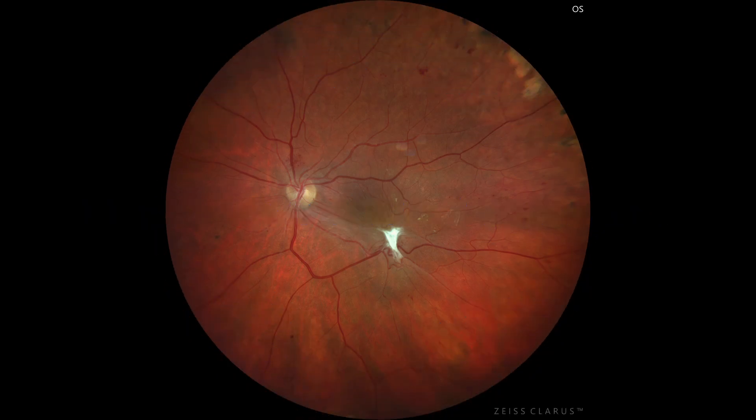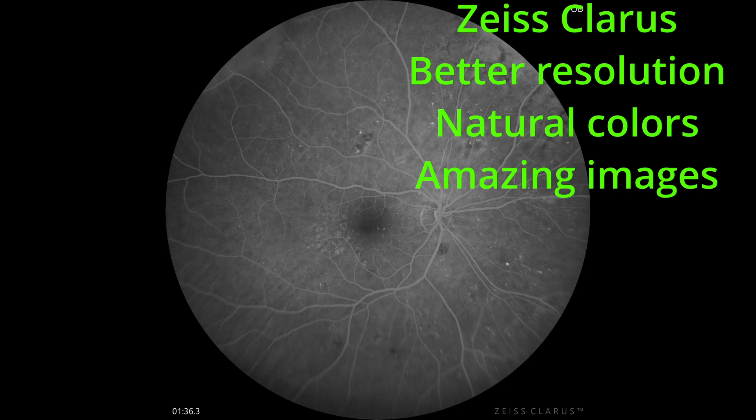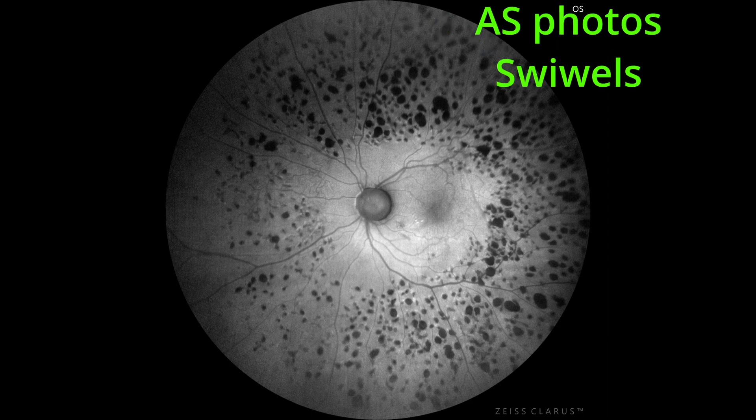Now for the competition. The first competitor is the Zeiss Clarus, which takes amazing images — there is something mesmerizing about them. Because it's confocal but not a scanning laser system, the colors are very natural, very close to indirect lens ophthalmoscopy. There are two types: the 500 with fundus photo and autofluorescence, and the 700 with fluorescein angiography. It has two types of autofluorescence, takes anterior segment photos, and swivels, so you can reach further into the periphery if the patient doesn't cooperate.